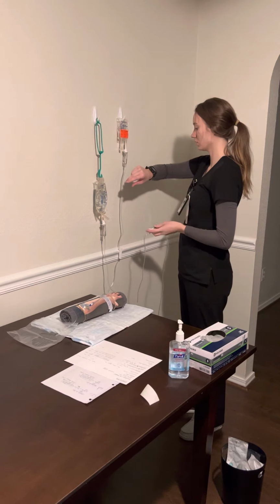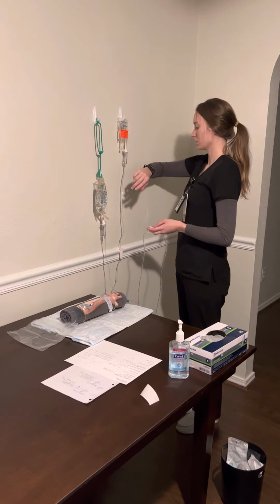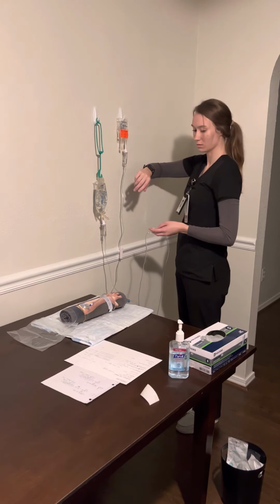So we have 1, 2, 3, 4, 5, 6, 7, 8, 9, 10, 11, 12, 13, 14, 15, 16, 17, 18, 19, 20, 21, 22, 23, and 24.